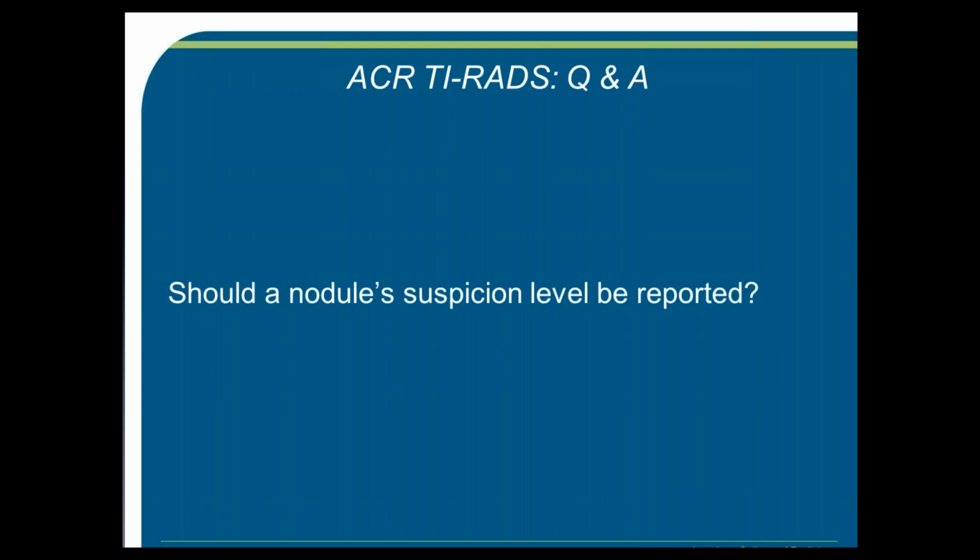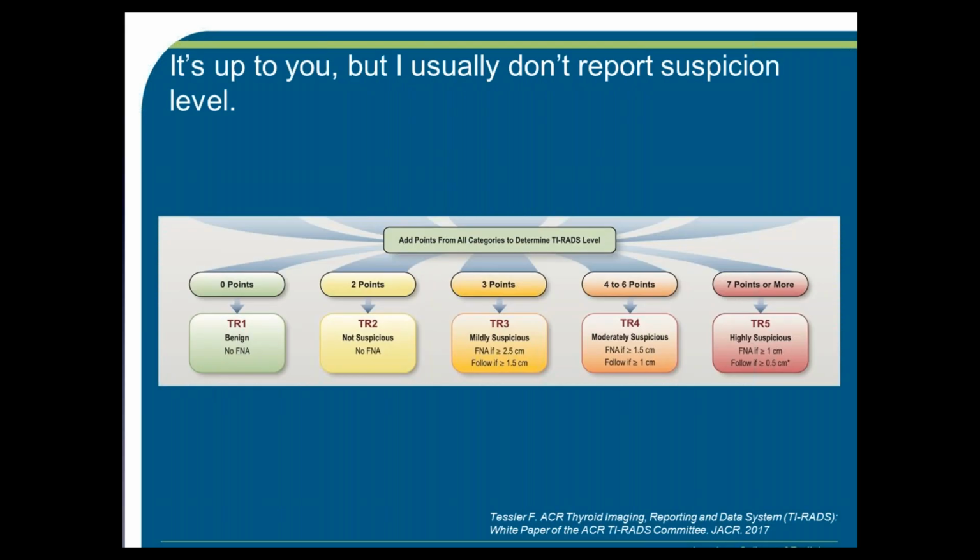Next question, should a nodule suspicion level be reported? This is a very frequent question that I've received from people in multiple places, so I'll deal with my perspective on it. Here's the relevant part of the ACR TI-RADS chart. My answer to this is it's really up to you, but I usually don't report suspicion levels.